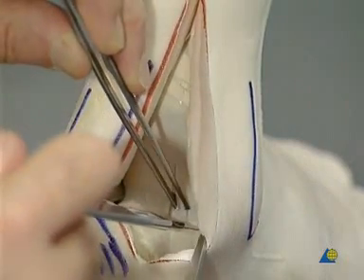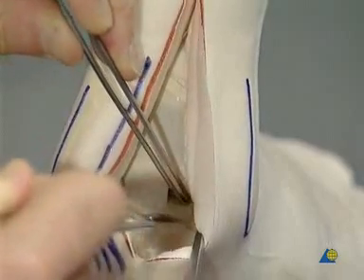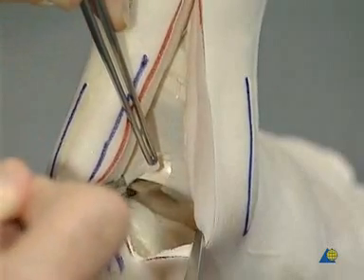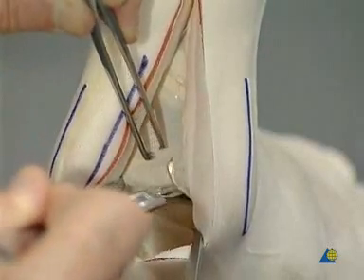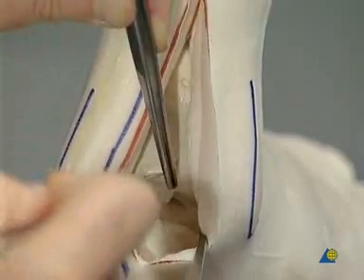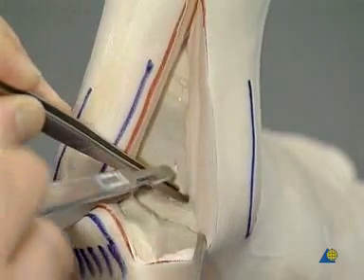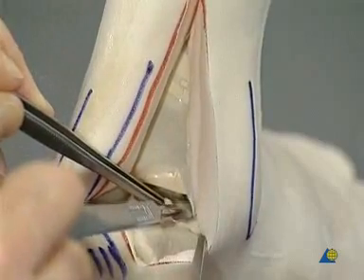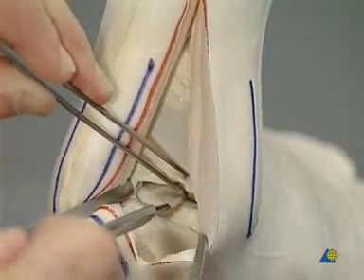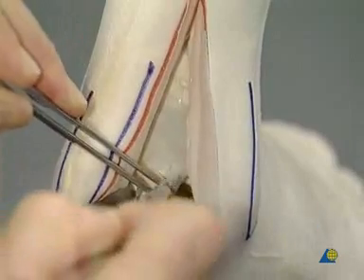An arthrotomy of the subtalar joint is performed and the capsule is removed. The posterior fibulotalar ligament is also removed, leaving the subtalar joint free.